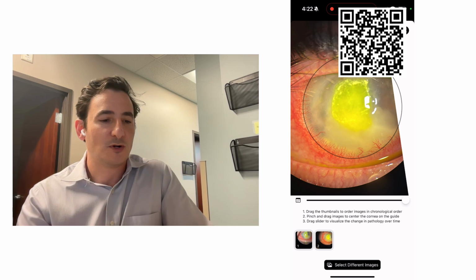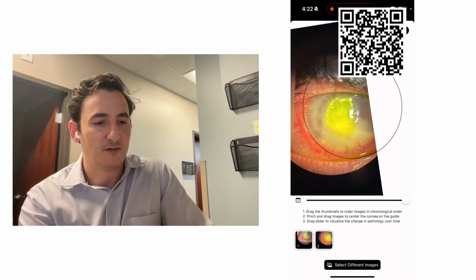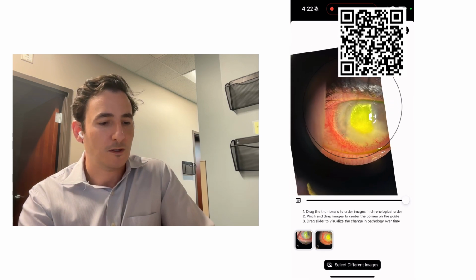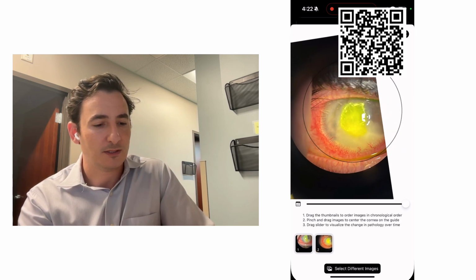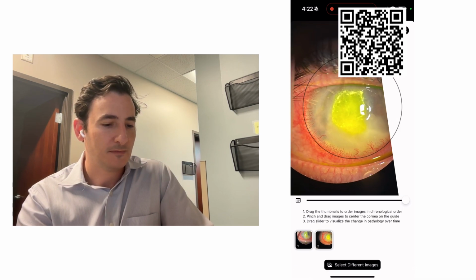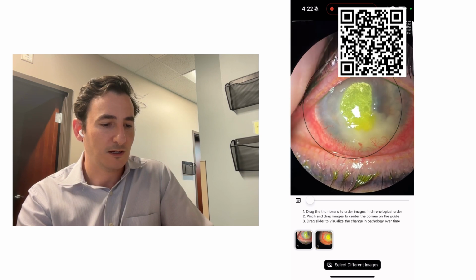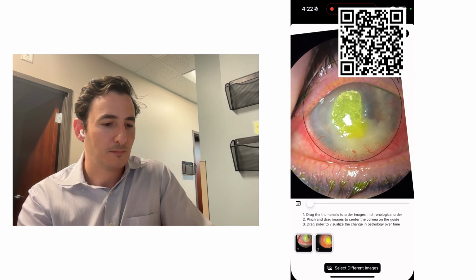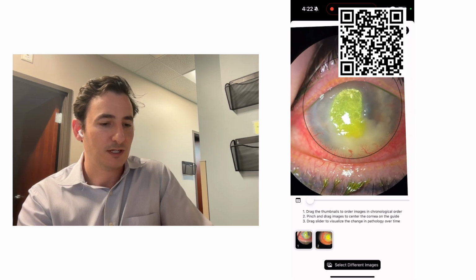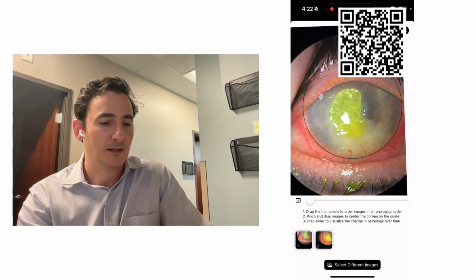And you can see I'm going to rotate this a little bit because that 6 o'clock blood vessel is just a little off on this one. So I'm going to rotate the image here just so we have a more, let me see here. So I'm going to put it about here. And this image, I'm going to rotate it so it's about here. And maybe a little bit bigger. So it takes some time to get it just right. That's a little bit better.